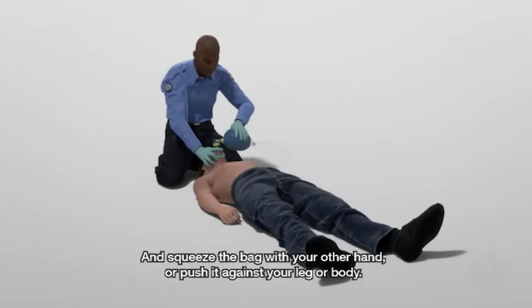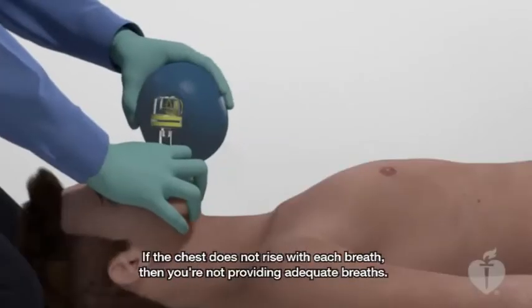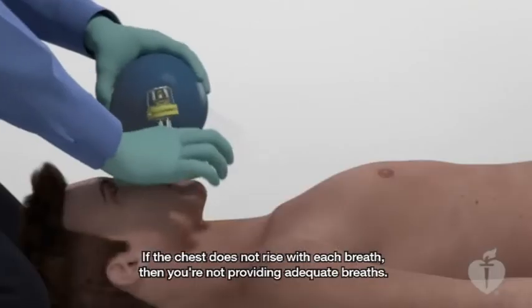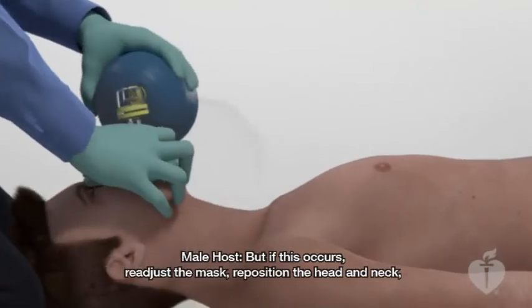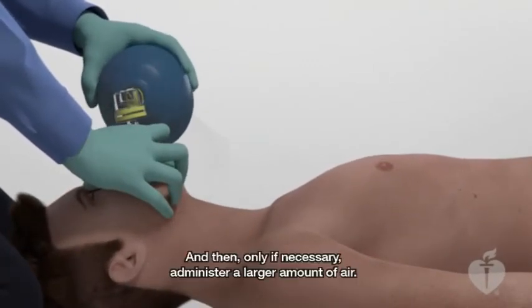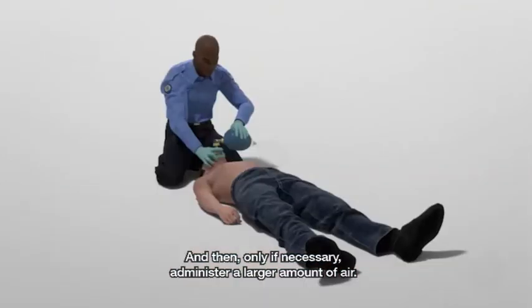And squeeze the bag with your other hand or push it against your leg or body. If the chest does not rise with each breath, then you're not providing adequate breaths. But if this occurs, readjust the mask, reposition the head and neck, and attempt to ventilate. And then, only if necessary, administer a larger amount of air.